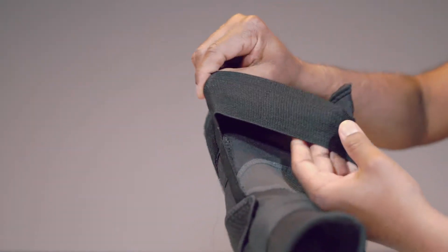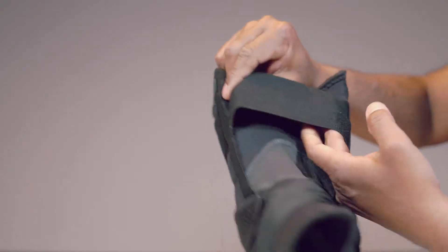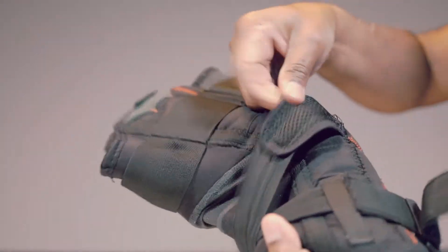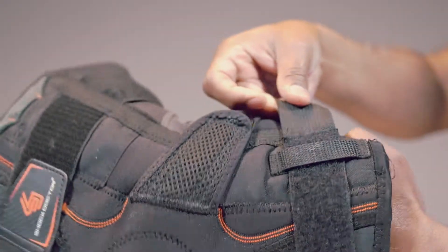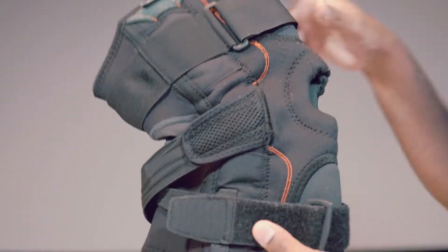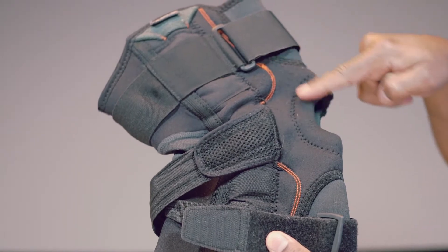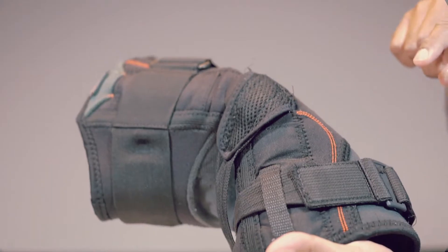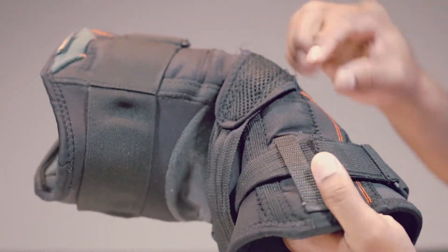Here we have these conical straps. This is an integrated flexible side stabilizer to provide added support. The brace design is a little curved to provide enhanced fit and comfort. These padded patella buttress helps protect and stabilize the knee cap.